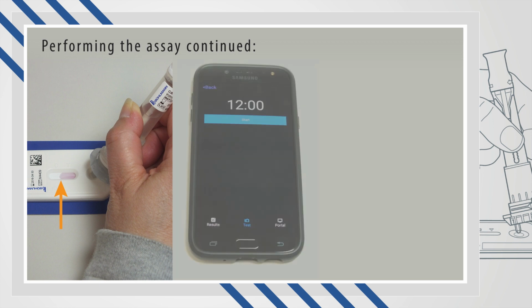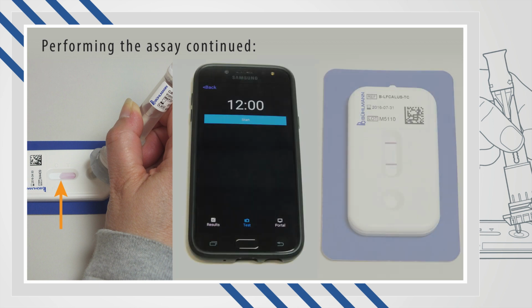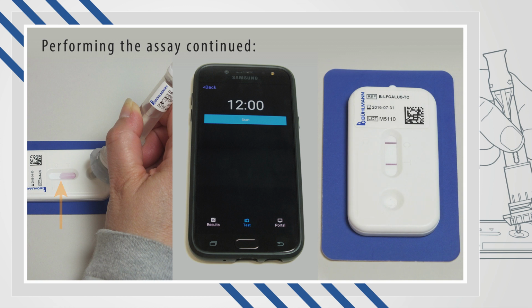At this point, you start the timer on the app. 2 lines will develop in the reaction window. The line next to the C is a control to ensure that the test has run correctly. The line next to the T is your test. This line will appear faint in low levels of calprotectin and darker with higher levels. It is this colour intensity that the app uses to determine the concentration of calprotectin that is present in your sample.